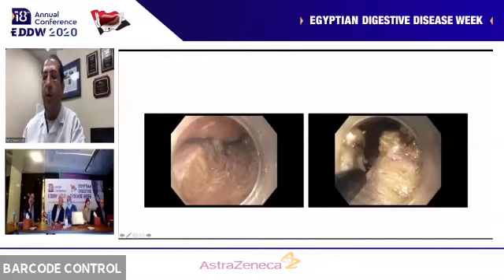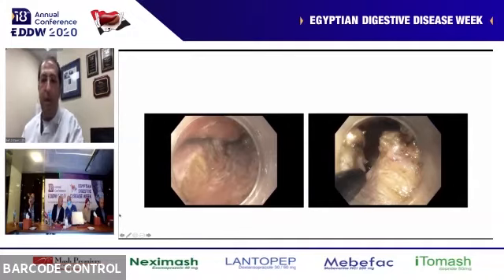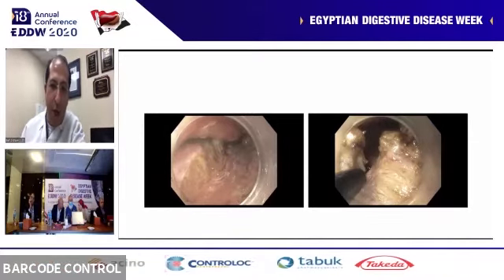Initially, Inoue was doing circular myotomy, leaving the longitudinal muscle of the esophagus alone. Now all the endoscopists, and I'm sure a lot of you do these POEM procedures, know that everyone has now evolved to full thickness myotomy, especially in a posterior approach. It's very safe.